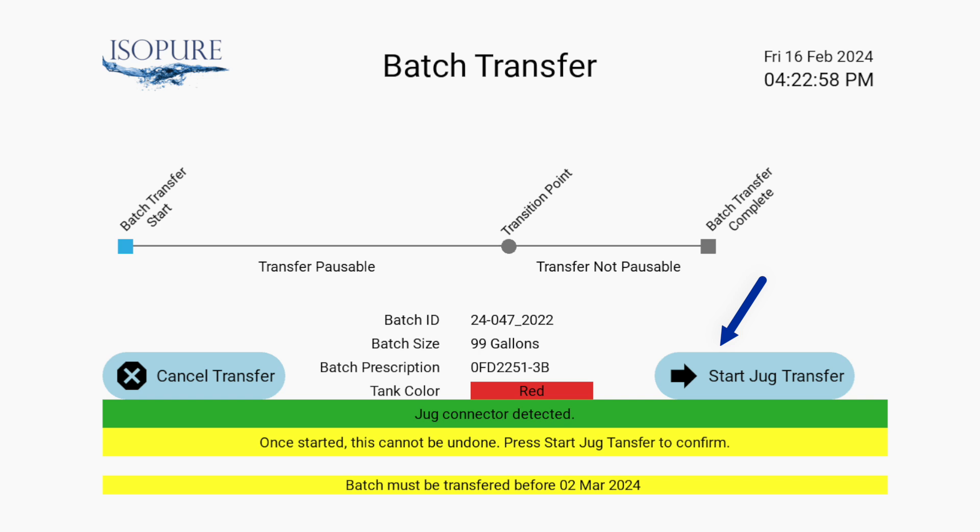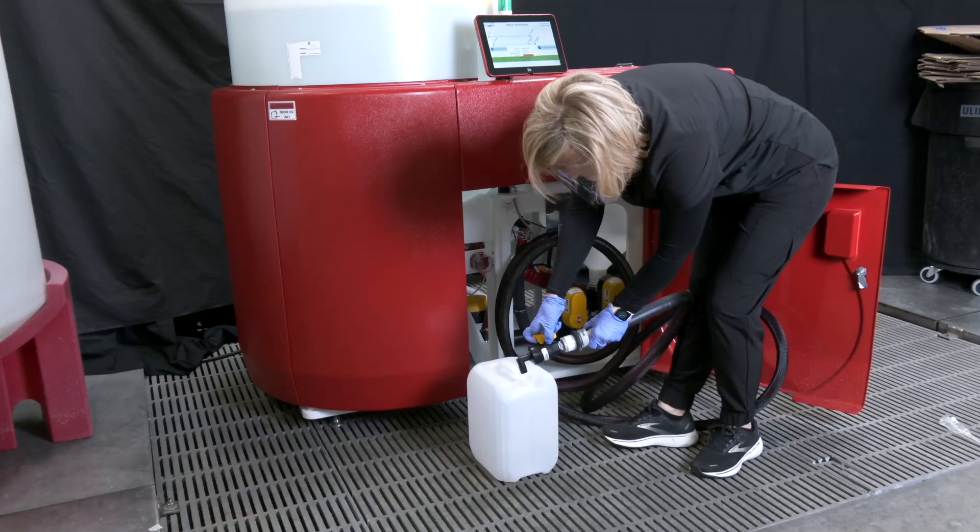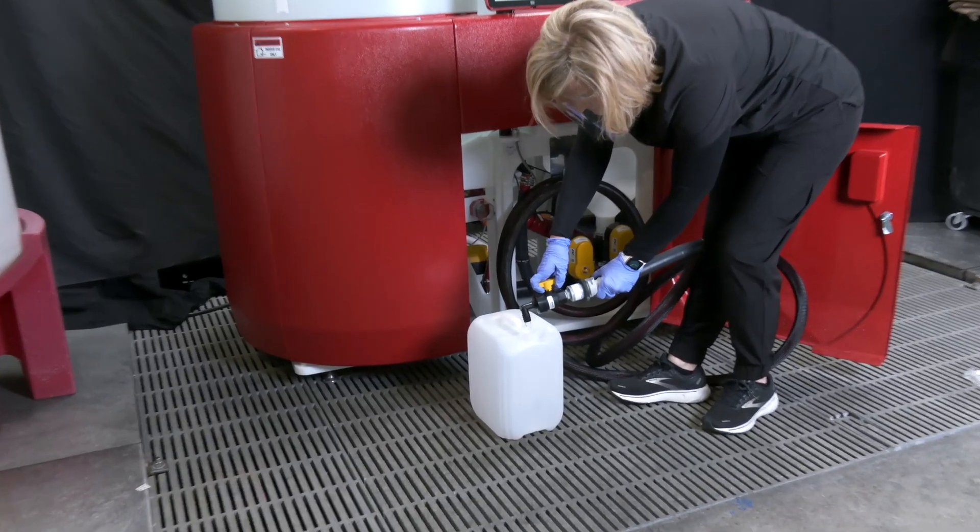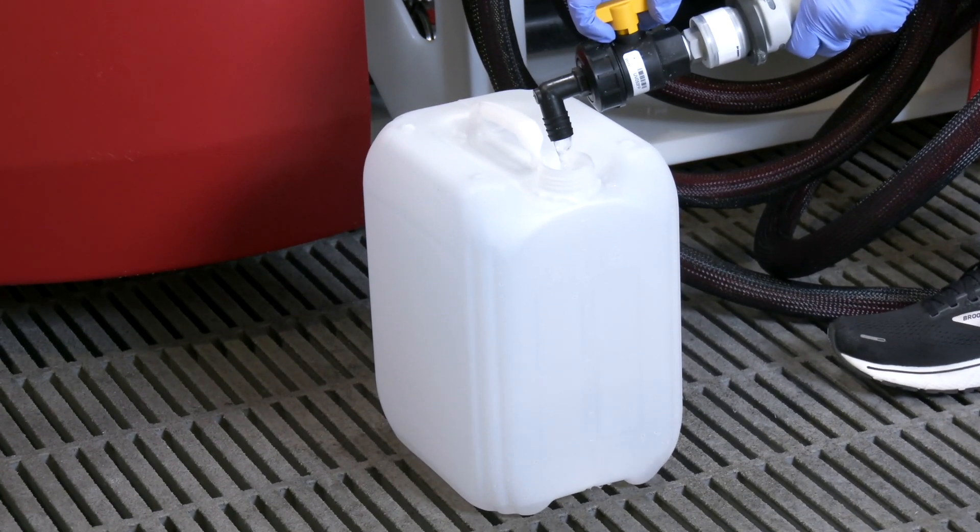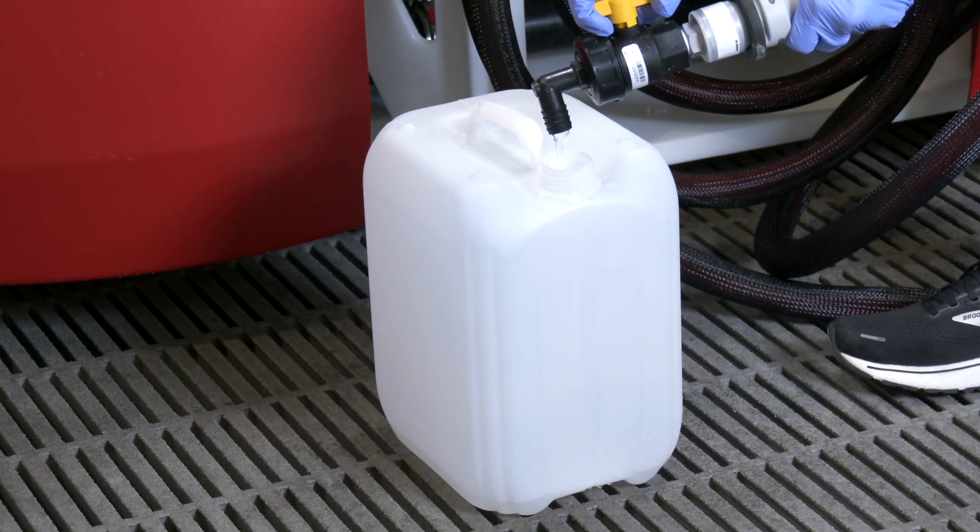Once Acumix detects that the jug transfer assembly has been connected, the start jug transfer option will appear on the screen. Select this option, then position the assembly over the jug opening. Using the on-off valve to regulate the outflow of acid, fill as many jugs as required.